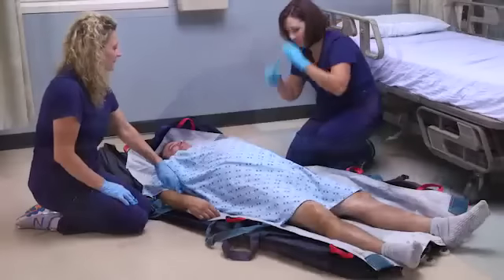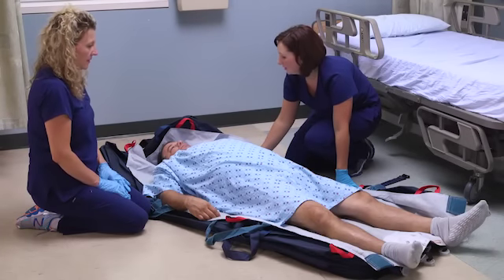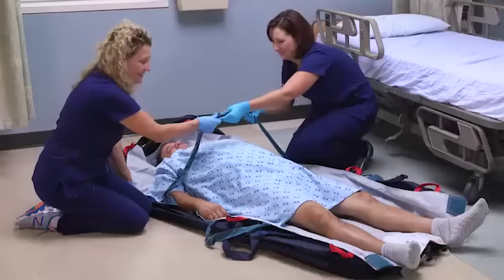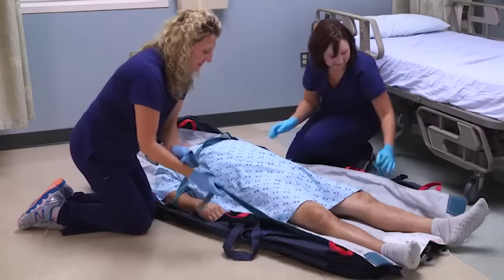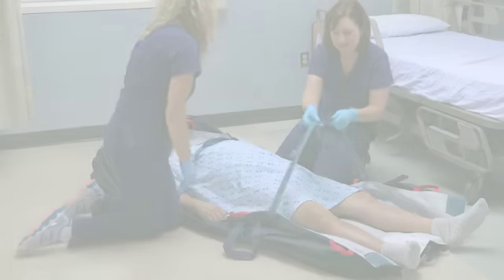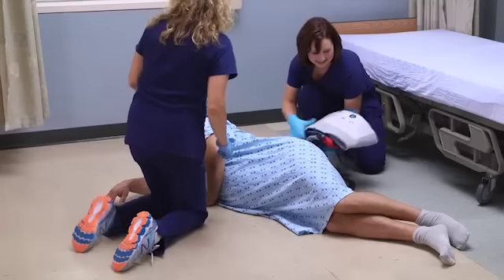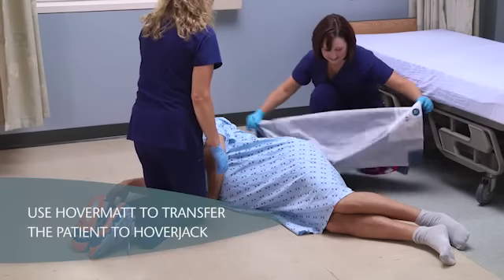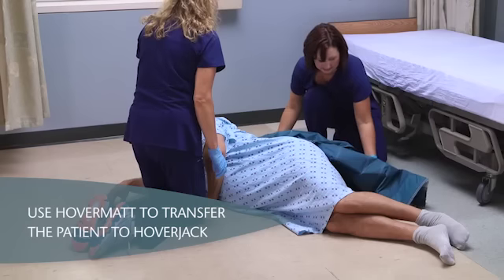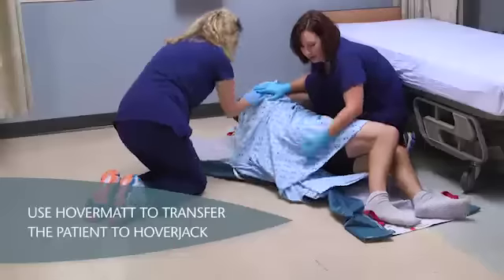If a HoverMat is available, place it on top of the HoverJack so both can be positioned under the patient simultaneously. The HoverMat will be used to perform the lateral transfer onto a bed or stretcher. If the patient has fallen in a hard-to-reach place, such as the bathroom, the HoverMat may be used to extract the patient from the space and to move him or her onto the deflated HoverJack.